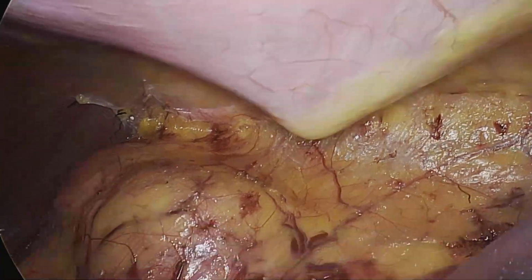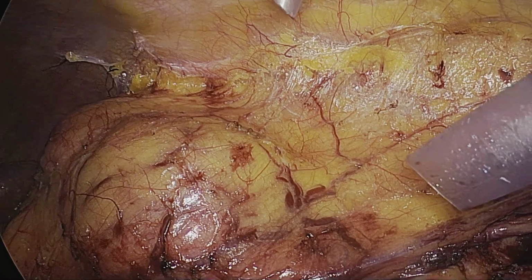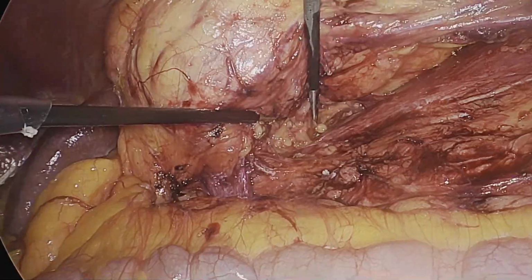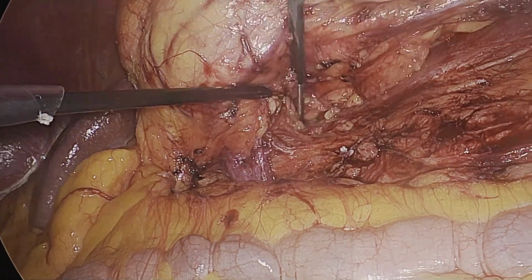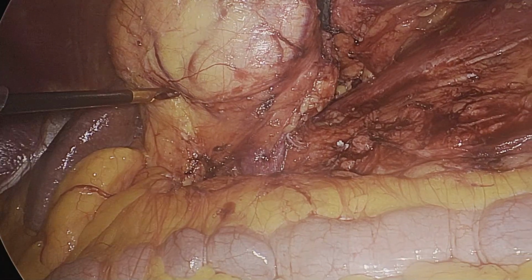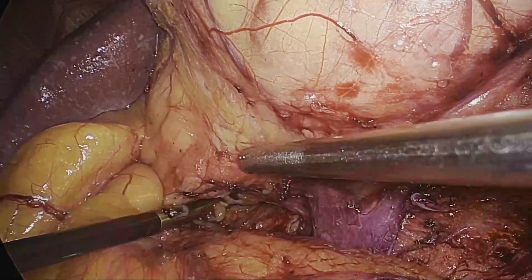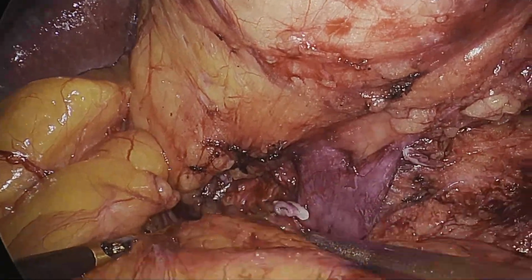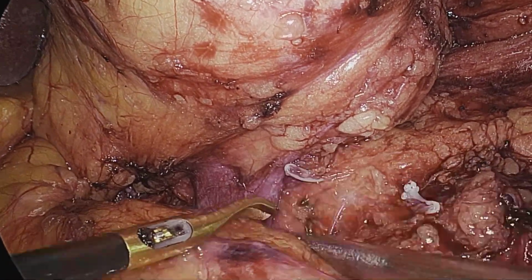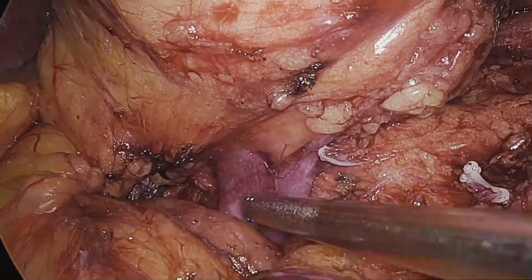So now a fourth port is being placed. This will help us retract the kidney laterally so that we can easily dissect the hilar area. And renal artery dissection is a particularly careful area to dissect. It has a lot of lymphatics around, and if injured, they bleed very profusely.